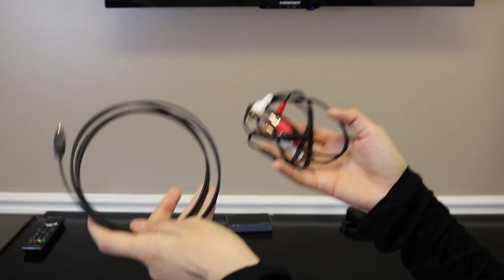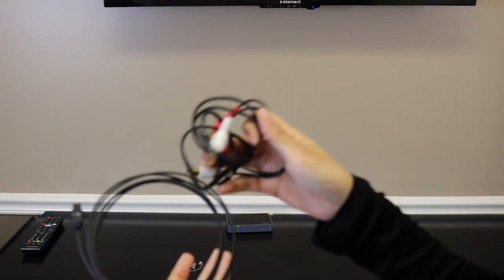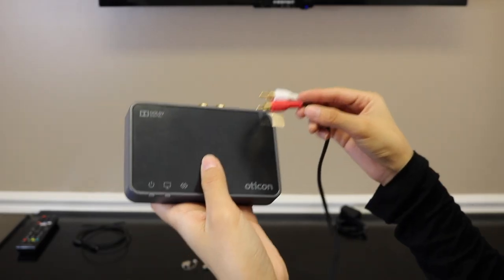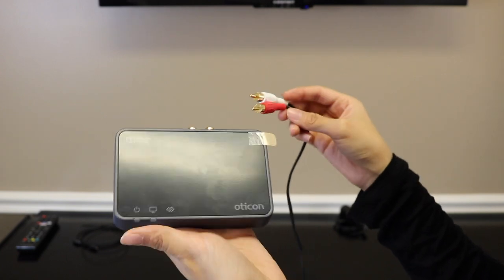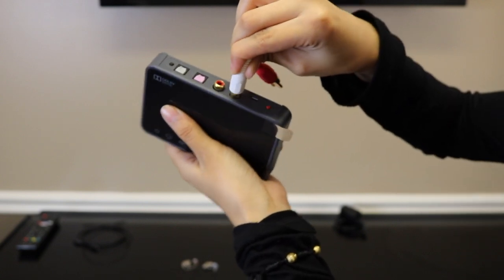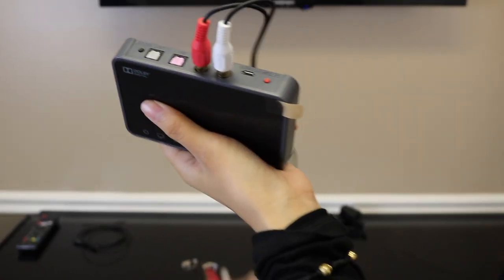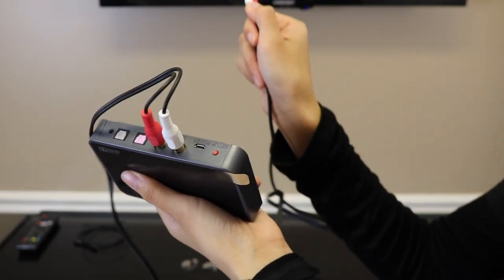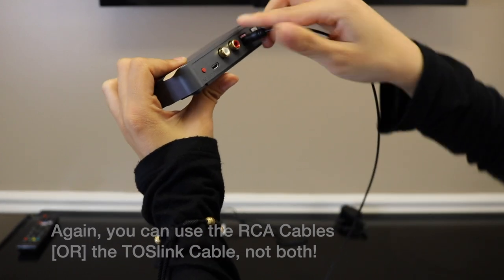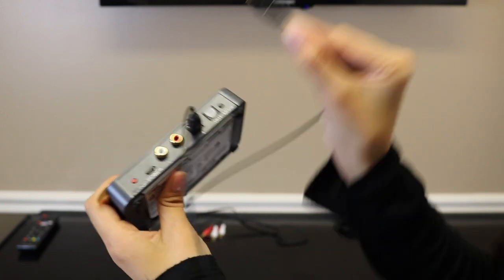With these two cables it is optional which one you want to use. A lot of people already have their RCA cable used up on their TV, so we recommend that you go ahead and use the TOS link cable. For the RCA cables, grab your adapter box and connect the white cord into the white insert, then the red with the red, and do the same on the other side into your TV. For the TOS link cable, take one end and insert it into the little pink insert on the adapter, then grab the other end and put that into your TV.